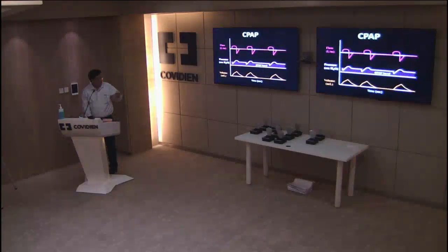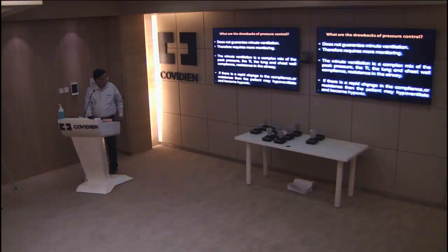That is, like I said, the patient is breathing continuously, otherwise the pressure is kept at 5 or whatever PEEP you have kept, and in between the patient is making spontaneous breaths. That is CPAP. So what are the drawbacks of pressure control ventilation?